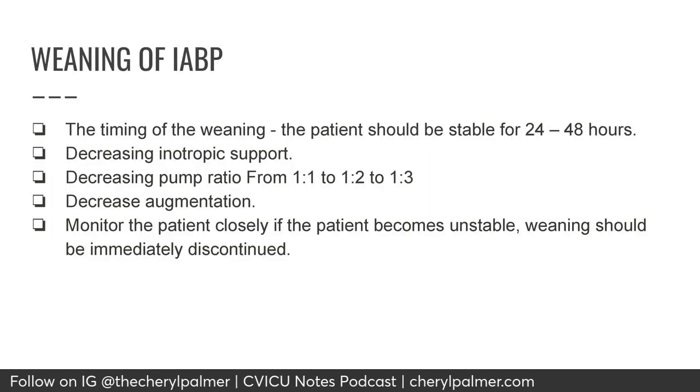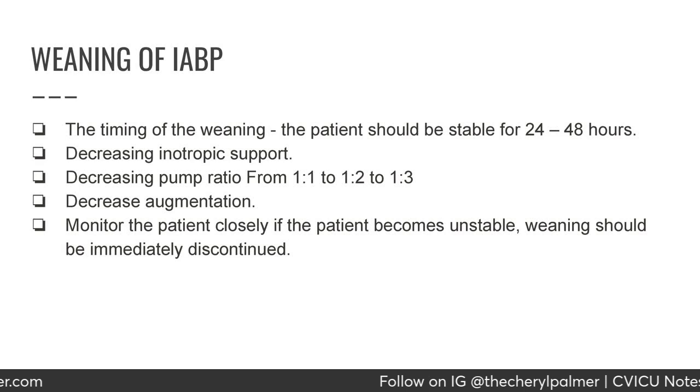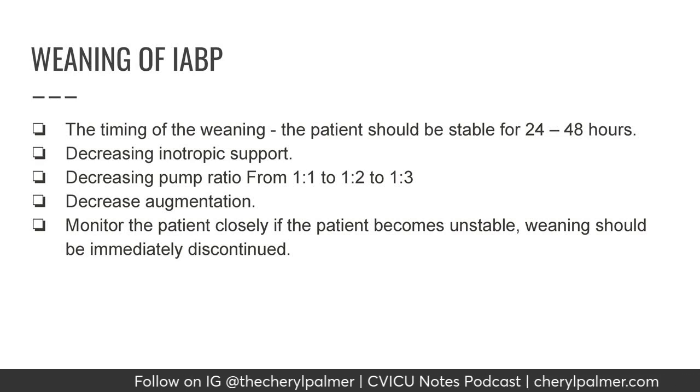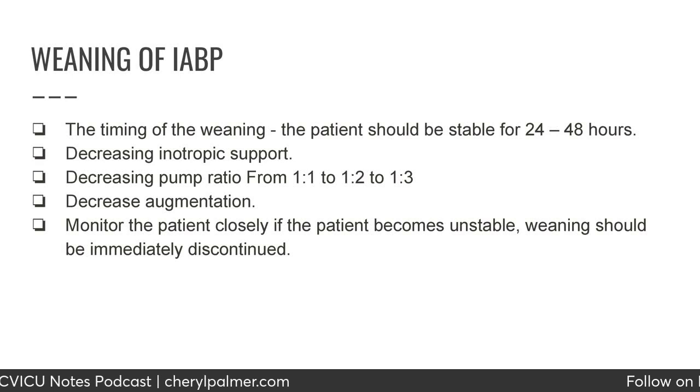Weaning of the balloon pump. The timing of the weaning: the patient should be stable for about 24 to 48 hours prior to that. You want to see a decrease in inotropic support. Decrease in the pump ratios. You go from 1 to 1, to 1 to 2, to 1 to 3.